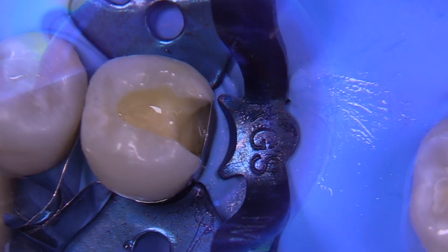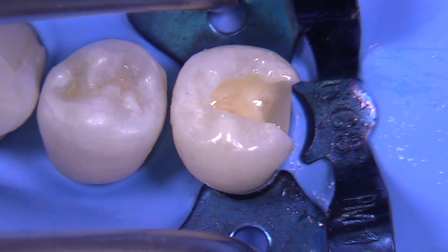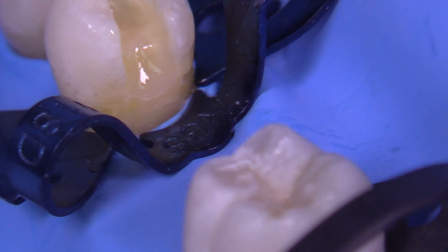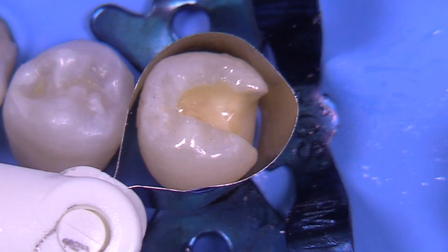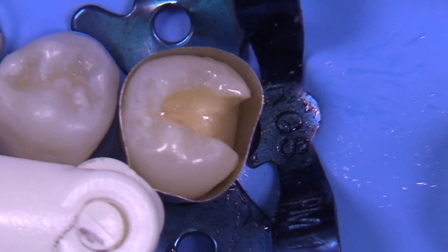After applying your various bonding agents — this video is not about bonding agents, use whatever system you like — we're now ready to go with either a flowable composite, a resin-modified glass ionomer, or a traditional glass ionomer in that gingival area. I frequently use Fuji 9 or some other type of glass ionomer down here. Now we've got a little gingival increment that adheres quite nicely.